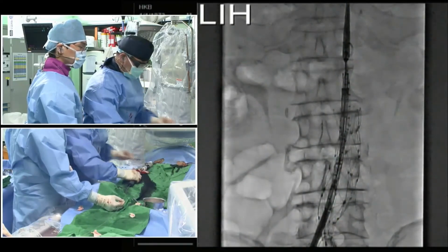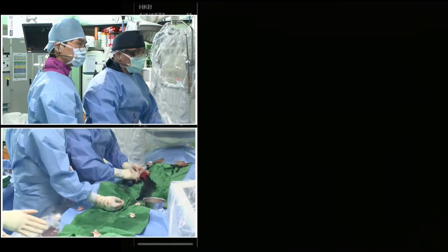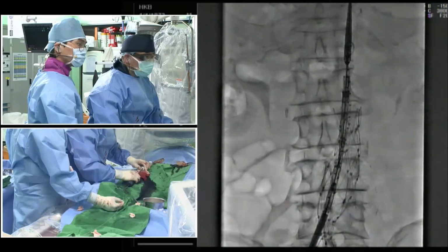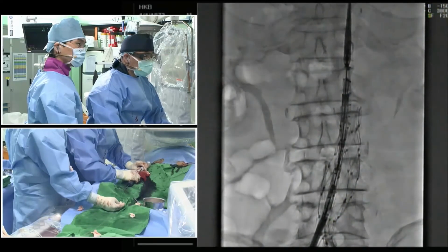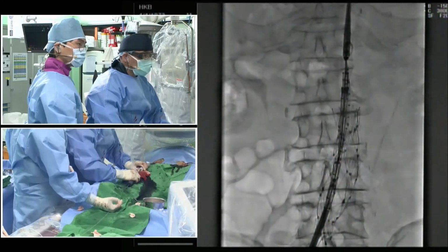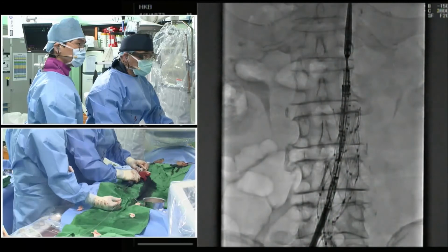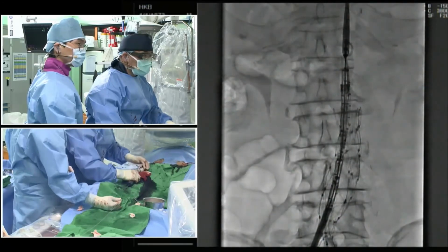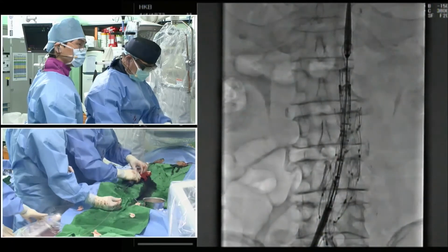Yes. Since it's tortuous neck anatomy, you may want to pull that back, and that'll help the graft tilt anatomically in the correct direction, with the right side down to the lower right renal. Might help. Yeah, but in this case, this patient does not have severe angulation. I think we'll go like this, okay?